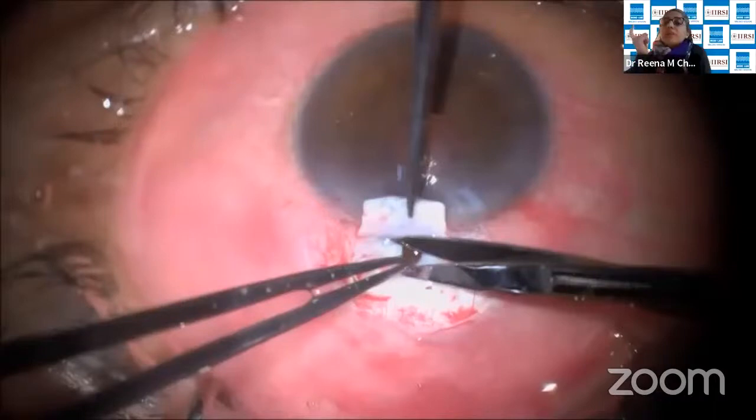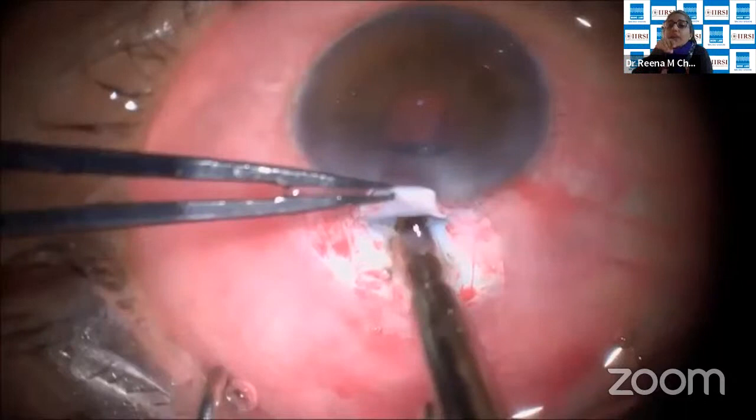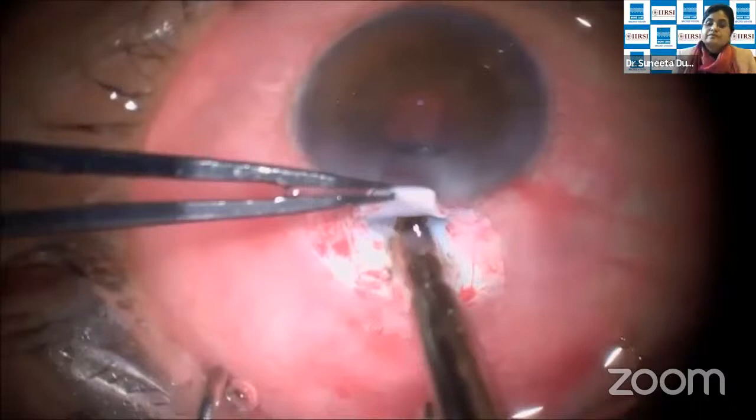I think the other important message for the beginners is how to make the entry. As Dr. Sunita was mentioning, you're not just removing trabecular meshwork; the surgical anatomy of the limbus is important here. When you're entering the AC, it's actually the cornea. You're entering in the clear cornea, and it's a bit of keratectomy along with the trabeculectomy. So if you are very posterior, you land up falling onto the ciliary body area, causing bleeding and failure of your trab. So the location of where you enter and how you create the ostium is very important. You're basically taking a little bit of peripheral cornea and the trabecular meshwork. You don't want to be very posterior.